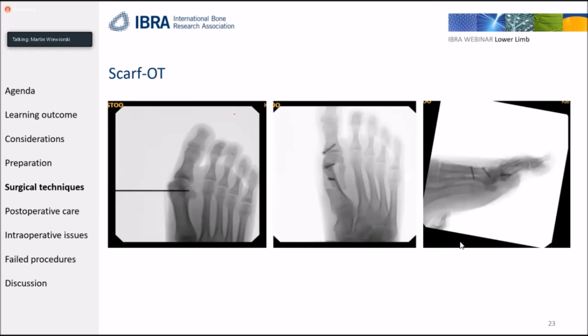So basically, maybe just to show you a bit of the intraoperative approach here. This is a typical patient with Hallux Valgus Juvenis. This is a typical configuration of the X-rays. Those patients mostly have, maybe this is just exaggerated, a pathological DMMA, and they have a congruent situation of the MTP1. So this is a congruent Hallux valgus. You can see it better when you open up the joint and look inside the joint.